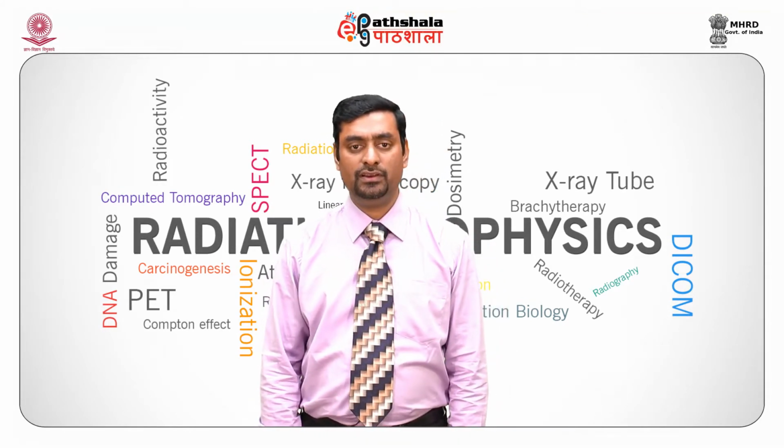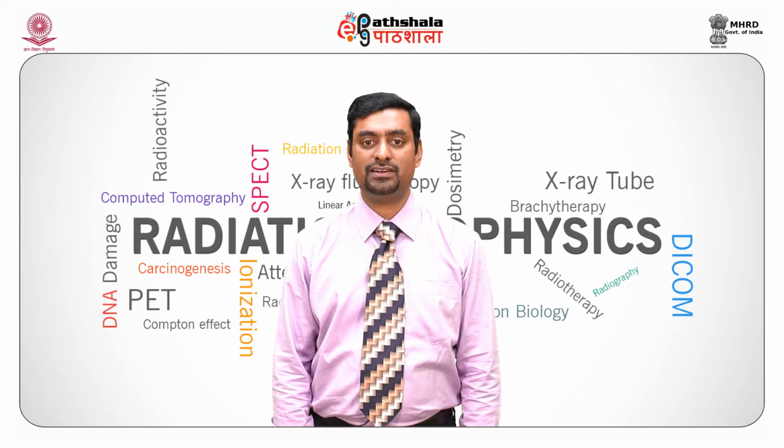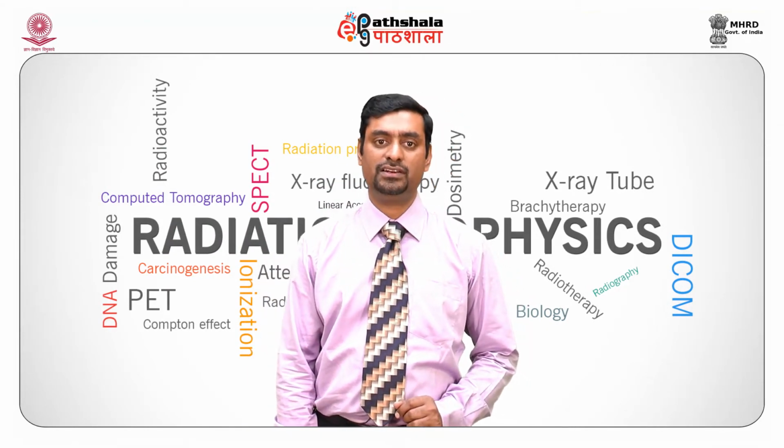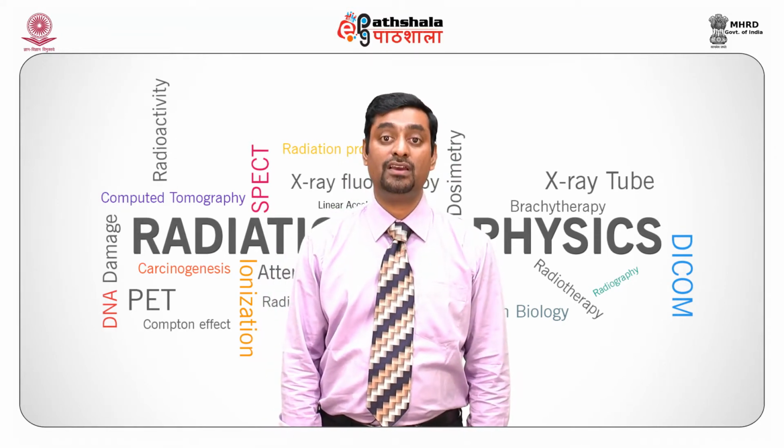Patient table. The patient table provides adequate strength to support large patients as well as results in minimal X-ray attenuation. Carbon fiber composite material is generally used as a patient table, which has about 0.5 to 0.75 aluminum equivalents.